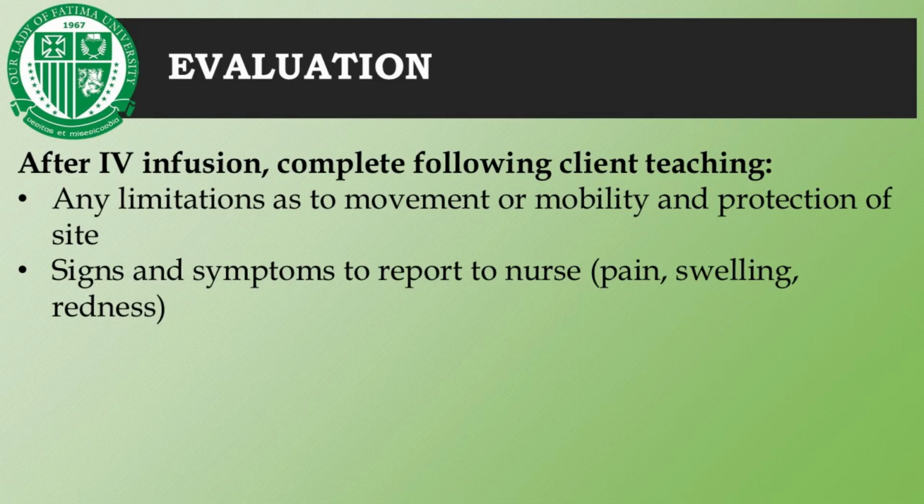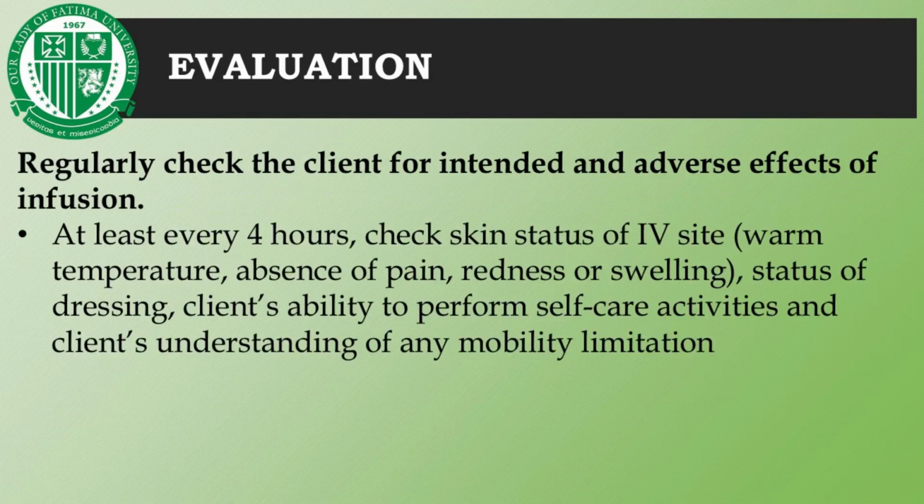Any limitations as to movement or mobility and protection of site. And the signs and symptoms that the patient should report to the nurse, like pain, swelling, and redness. The nurse should regularly check the client for intended and adverse effects of infusion. It is recommended and essential to check the patient at least every 4 hours.